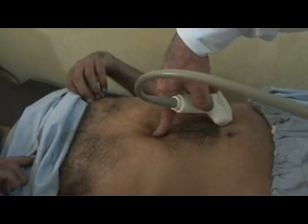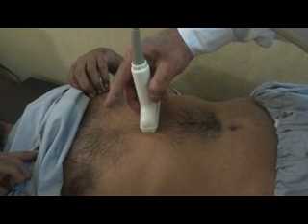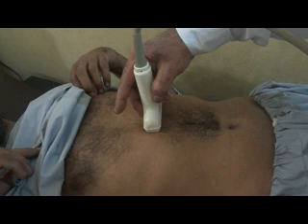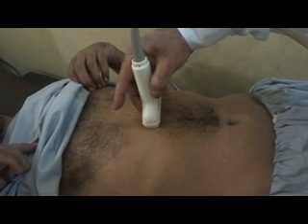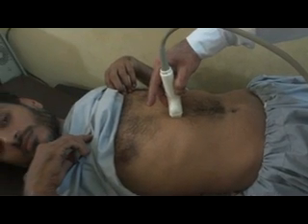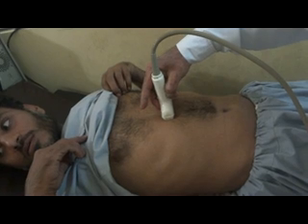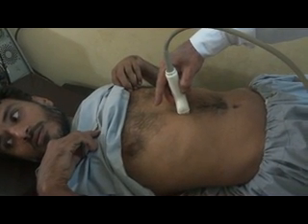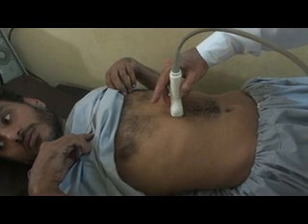Now, the pancreas is a retroperitoneal structure, and if the left lobe of the liver is enlarged a bit or exceeds the body of the pancreas, it becomes an excellent window to visualize the pancreas in transverse section.